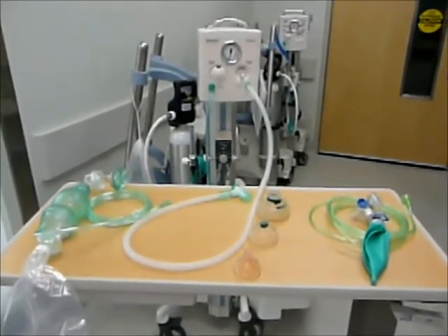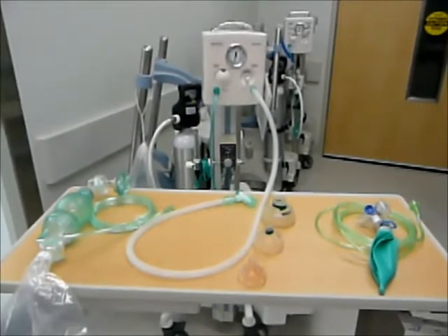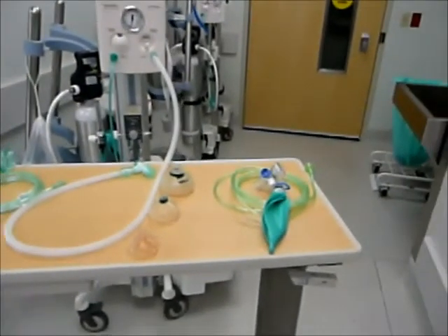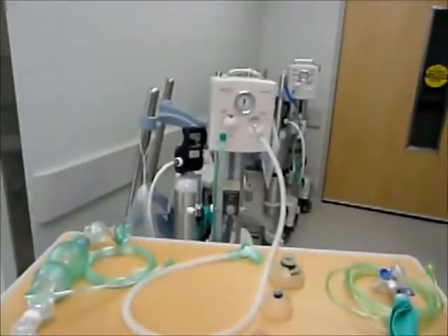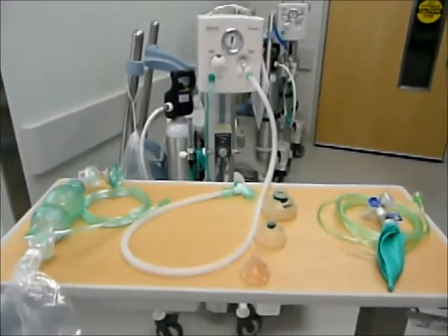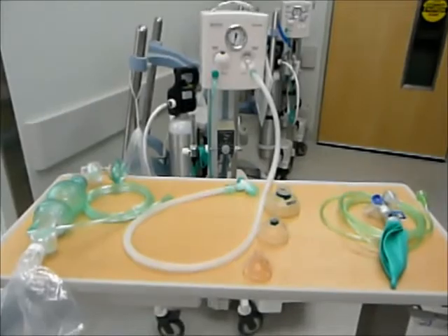Today we are going to be talking about resuscitation of the newborn. There are three ways you can provide resuscitation to the newborn: a flow inflating bag, a self inflating bag, and a T-piece resuscitator. Please take a moment to familiarize yourself with the advantages and disadvantages of these three pieces of equipment.